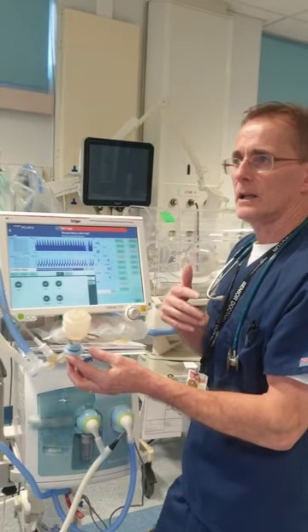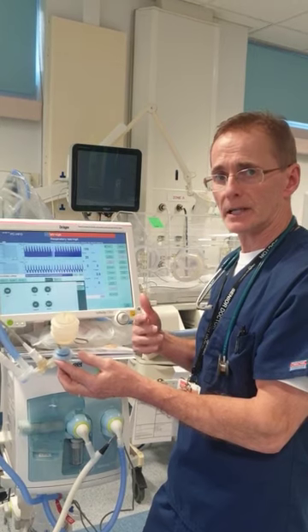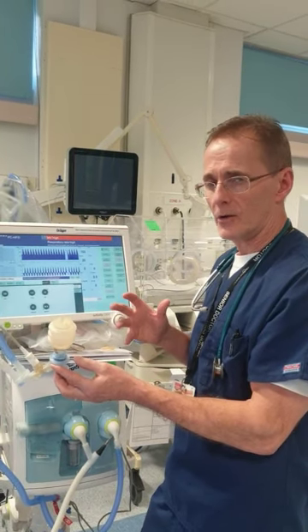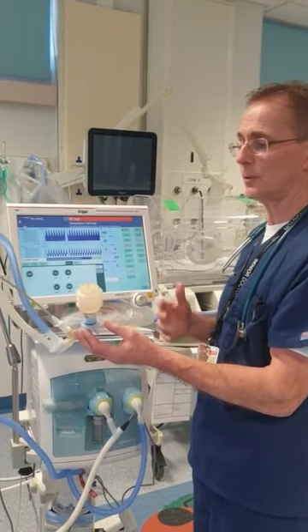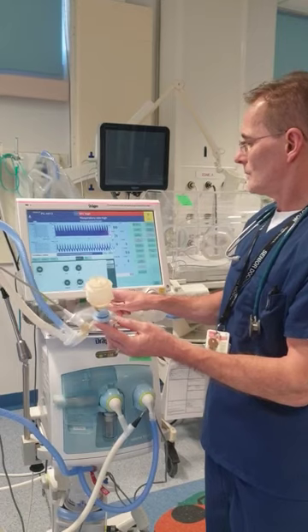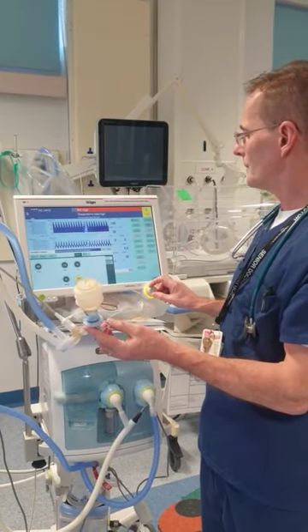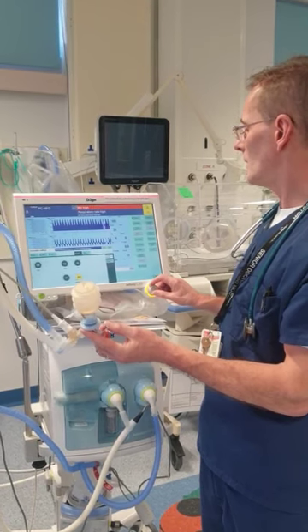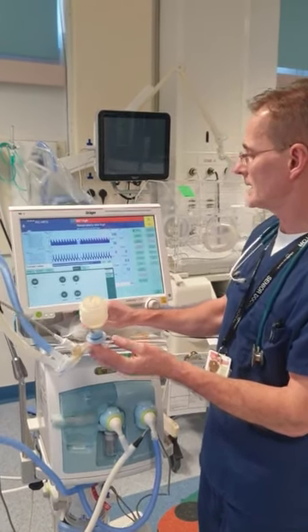And there's a rule of thumb that some will go, we can go up to say about 25 as a mean distending pressure before we're getting really a little bit anxious about whether we're potentially over distending, but up to 25 is completely appropriate. So let's say I've gone to 20, still no improvement. I'll go up another 1 centimeter as a mean airway distending pressure.